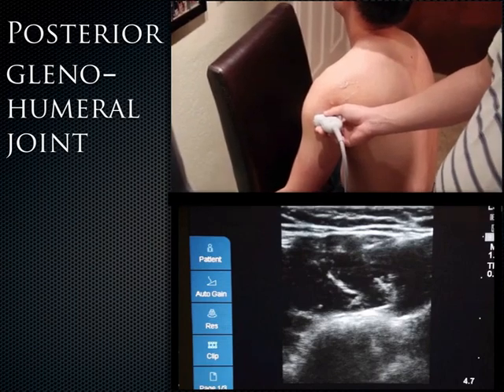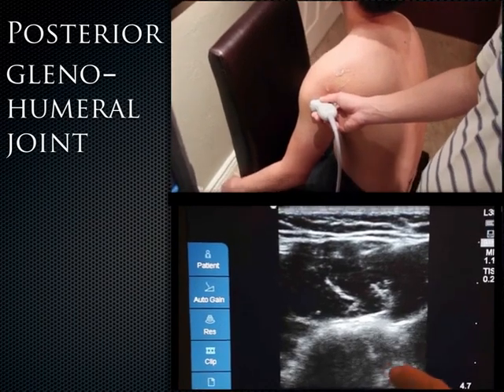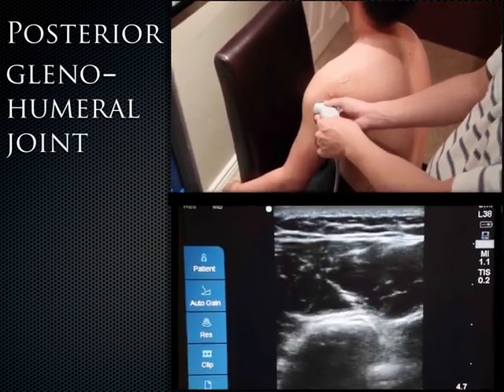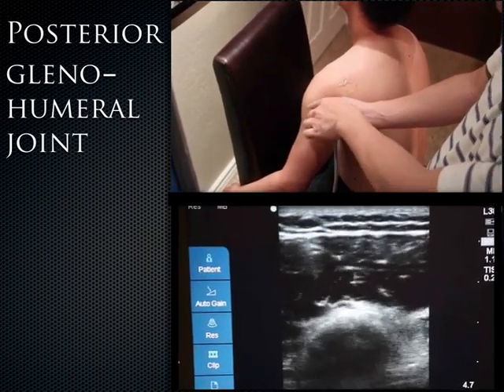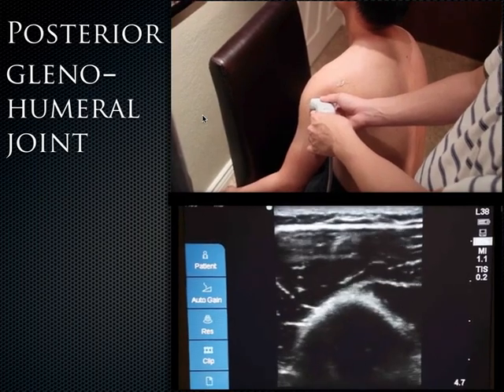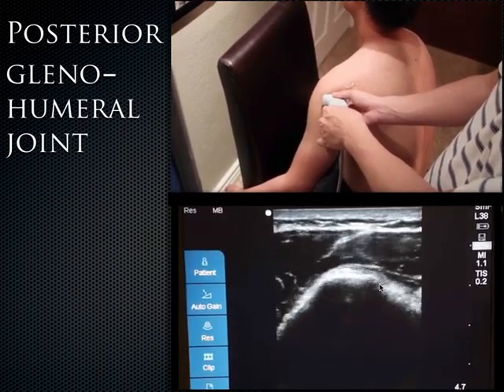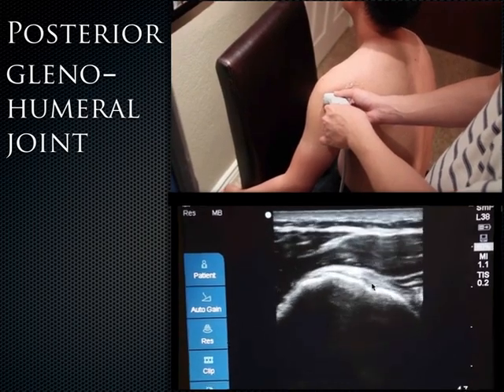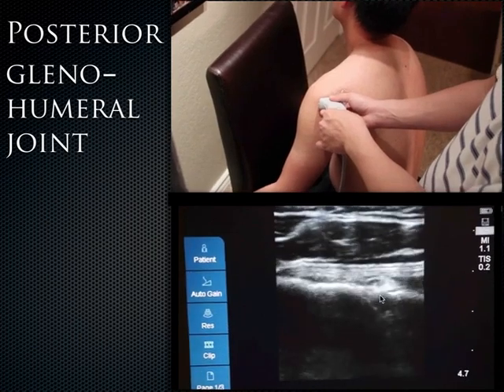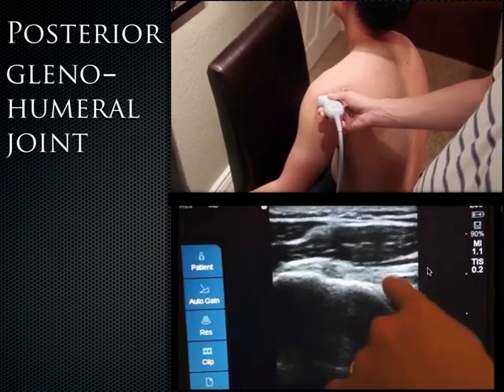Next, we're going to move to the posterior shoulder. And the first thing I capture is actually the humeral shaft in the short axis. So this is the humeral shaft right here. And what I'm going to do is move the probe superiorly, with the anterior point laterally, and what you'll see is that when you go to the humeral head, it becomes all knobbly. Once it becomes knobbly and enlarged, you start going more medially, and once you go more medially, you capture the infraspinatus tendon insertion onto the greater tuberosity right here.